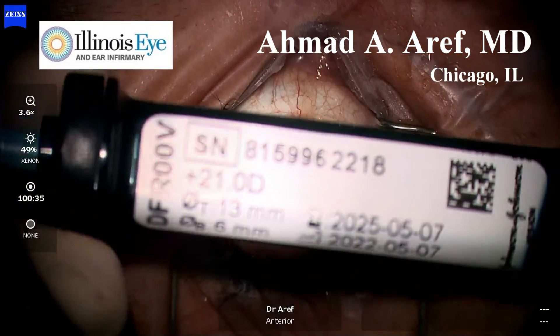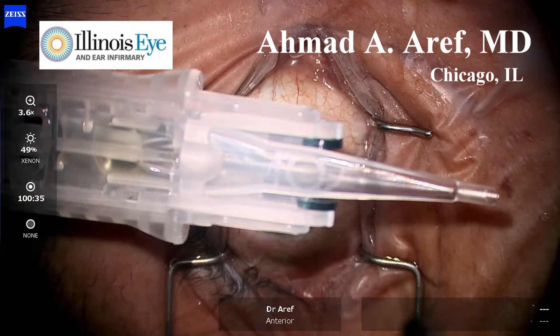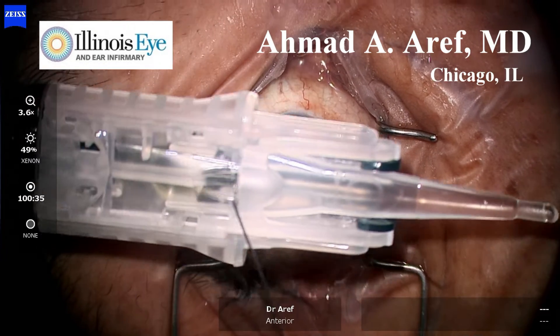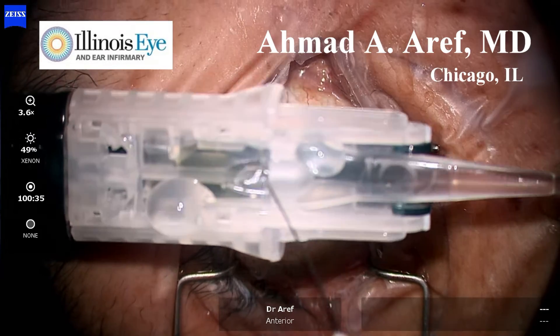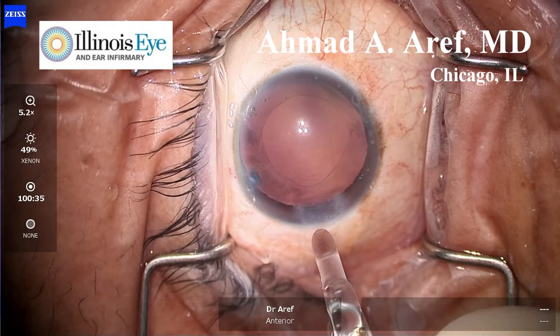This video demonstrates implantation of the Synergy intraocular lens using the Simplicity pre-loaded platform by Johnson & Johnson Vision. You can see the intraocular lens housed within a cartridge, which is filled with balanced salt solution. Balanced salt solution activates lubricants within the cartridge.